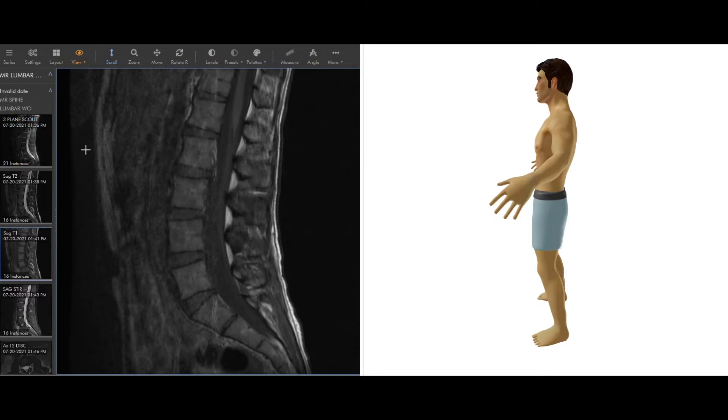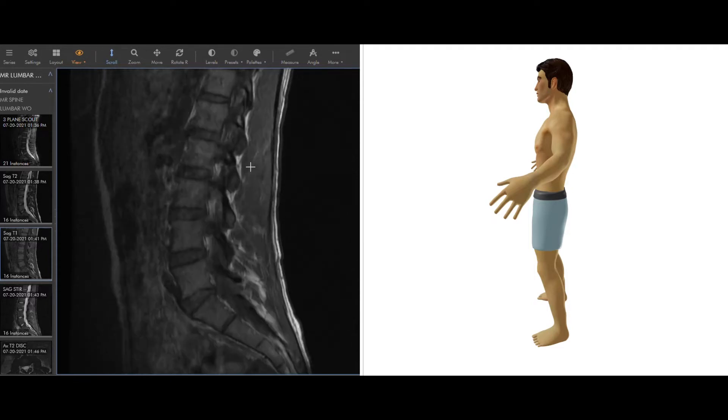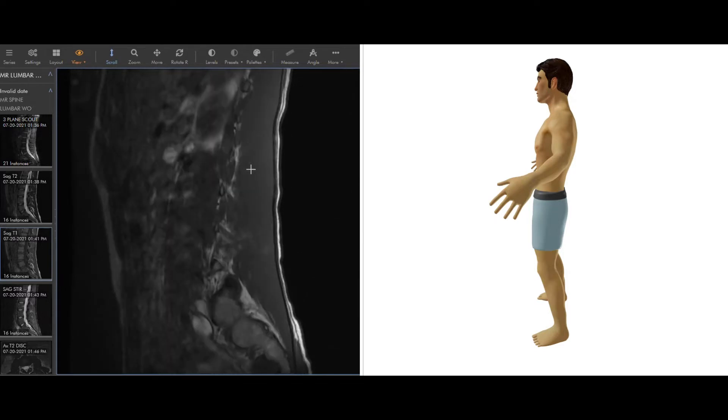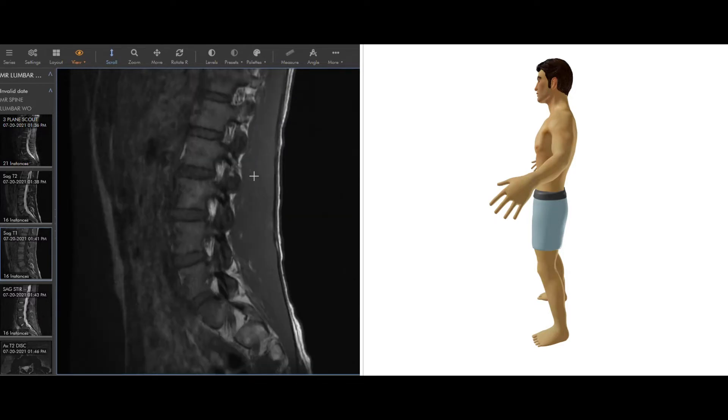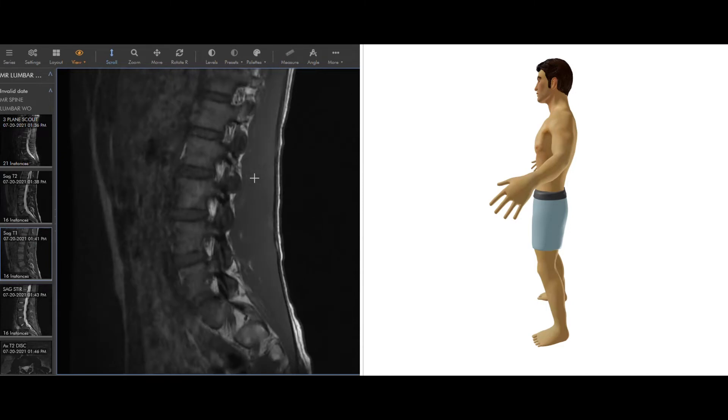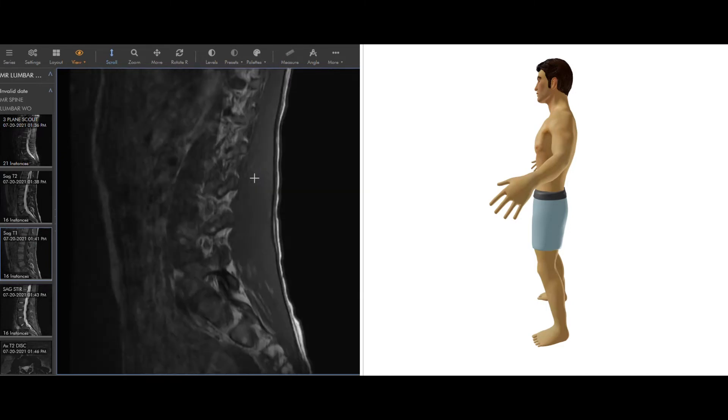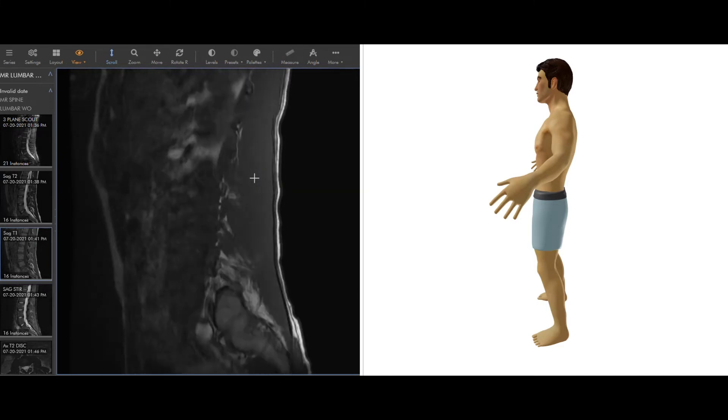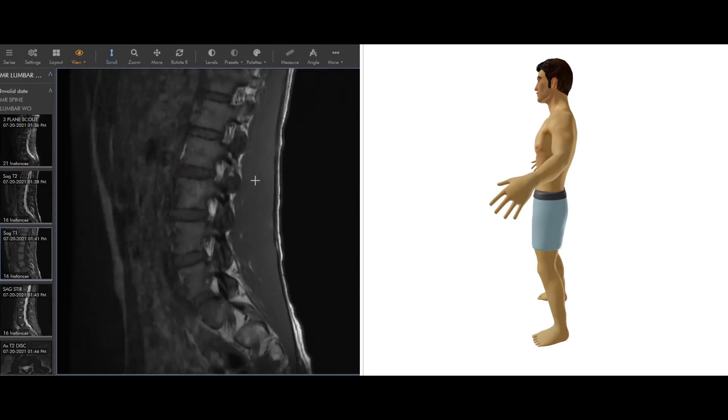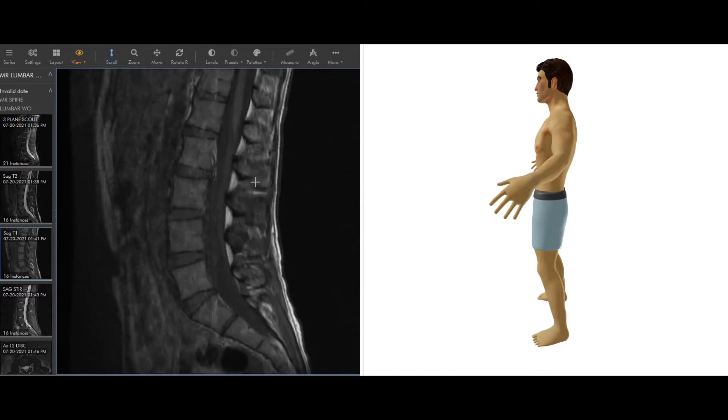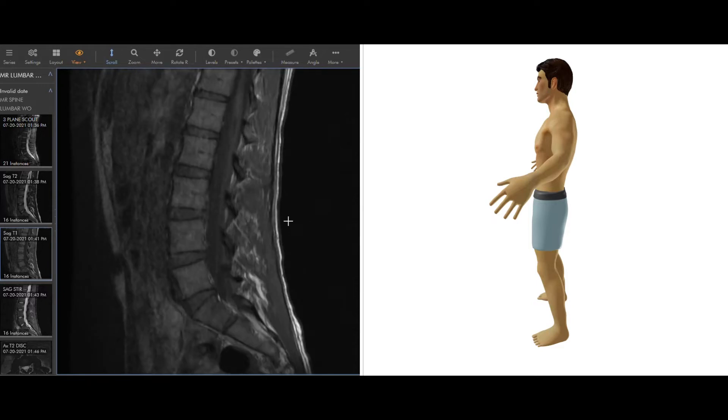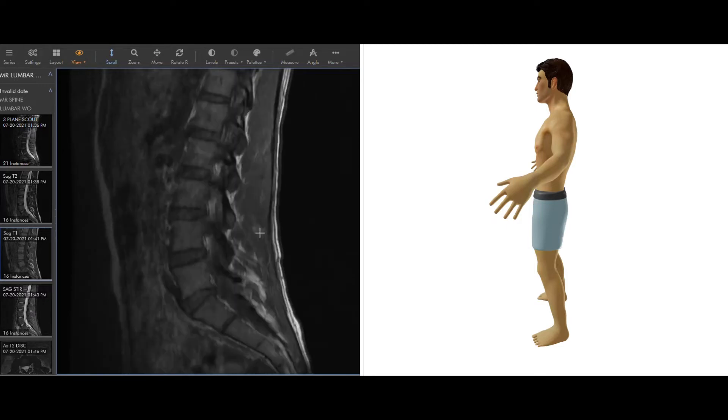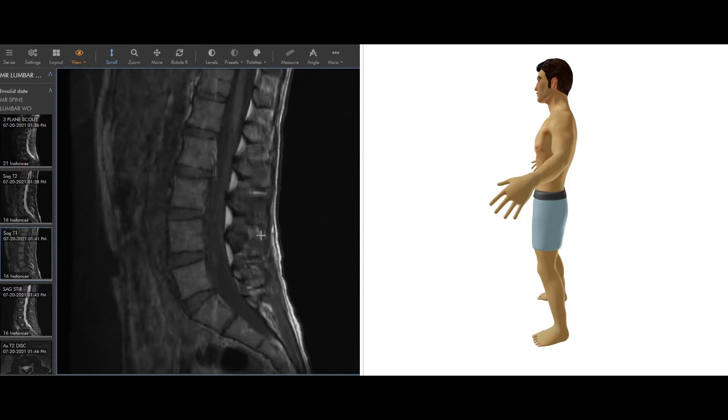As I'm looking here you can see we have one image on the screen. Now if I move the mouse you can see the images are moving, so we call this scrolling. We're moving images from side to side. One image is called a slice, and then each slice, all these slices added together, are sometimes called stacks of images. In an MRI, this whole thing is called a sequence.